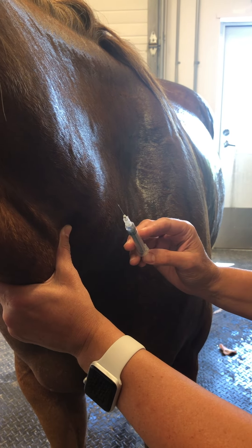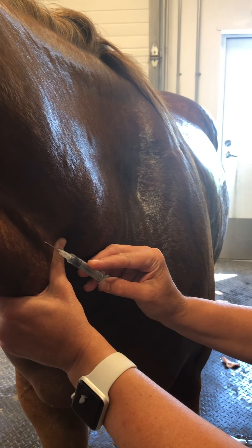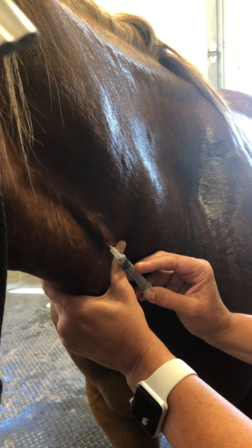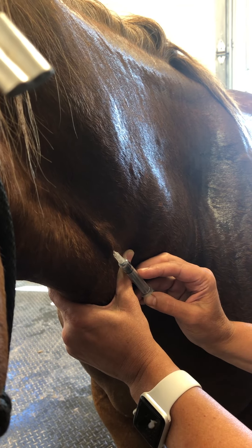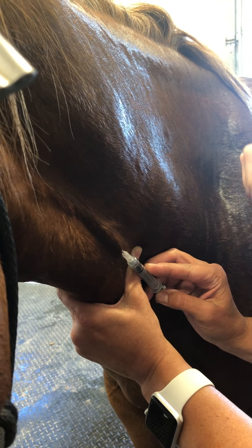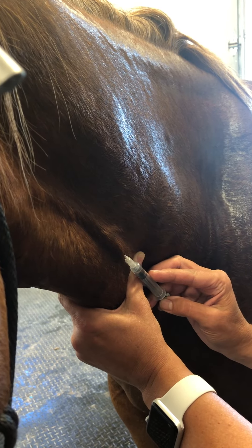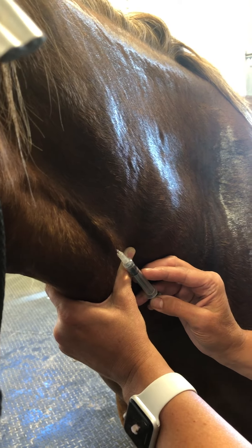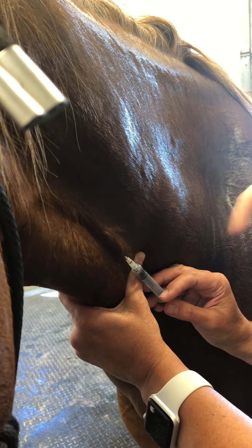Okay, all the way in — get that thing all the way in there. Now pull back gently. You're not in because you should pull blood. You're probably a little bit towards the surface, so let your tension go on your syringe — stop pulling.